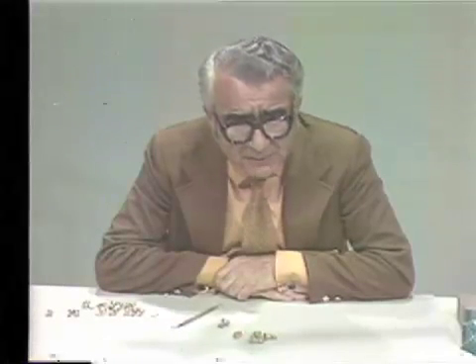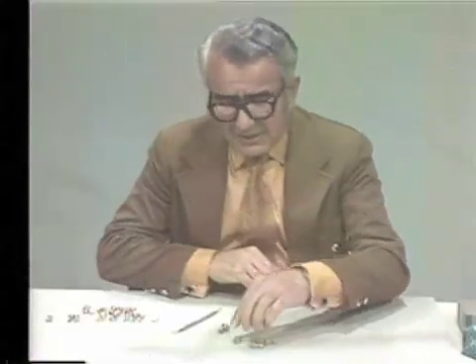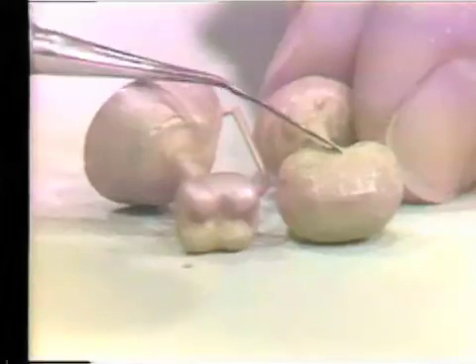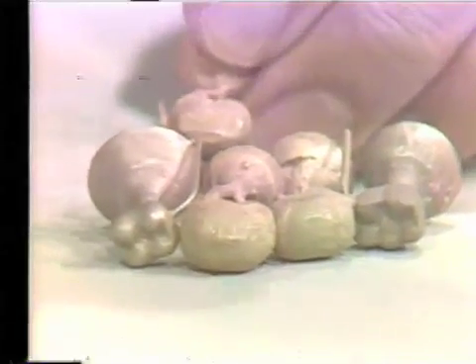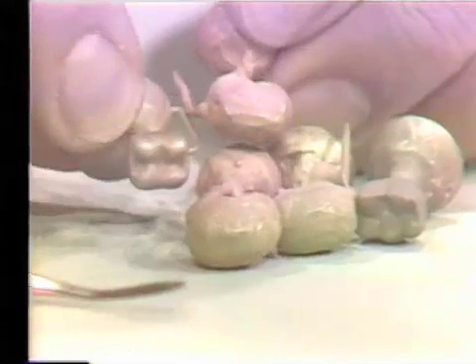One additional point: even though these are all done by thermally expanding investment — the type usually called high heat investment — neither Crystallite nor Luster Cast needs to be heated to 1,200 degrees Fahrenheit. They can all be cast at 900 degrees Fahrenheit without any damage. In fact, the surface will come out much better if you cast at 900 instead of 1,200. You can compare the surfaces here: the 900-degree Crystallite investment has a clearly finer surface than the 1,200-degree Crystallite investment castings.